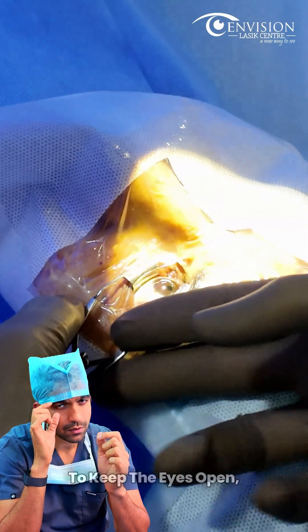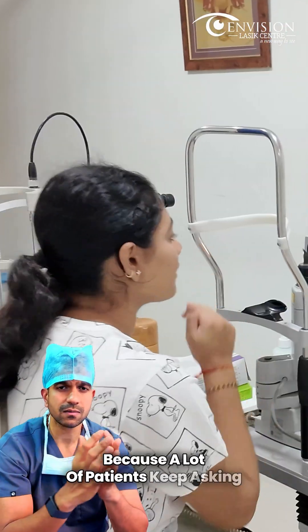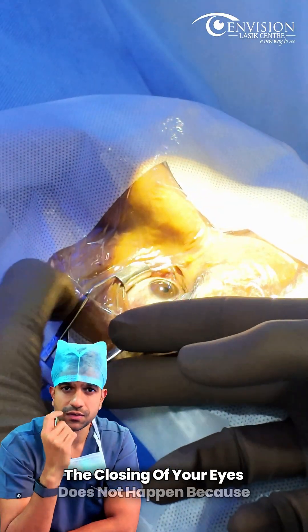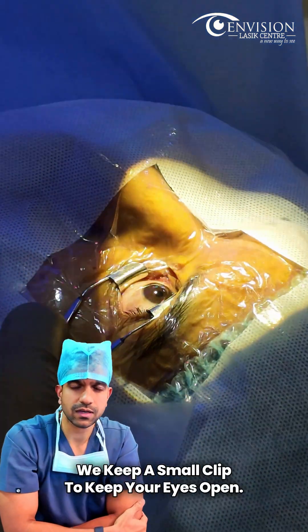We keep a small clip to keep the eyes open, because a lot of patients ask: 'Doctor, what happens if I close my eyes?' Well, the closing of your eyes does not happen because we keep a small clip to keep the eyes open.